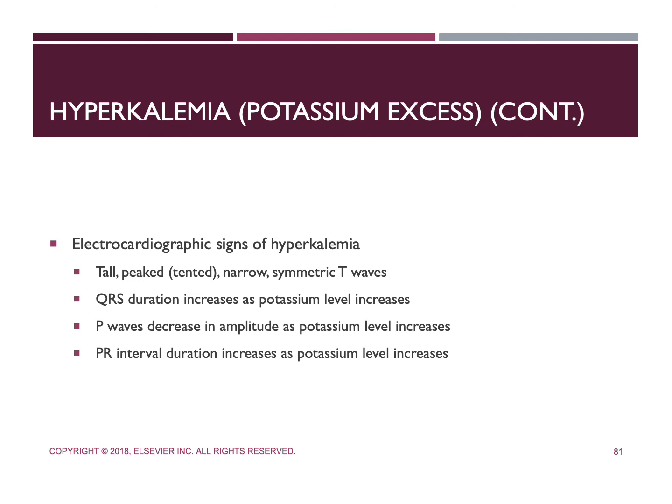As the potassium level rises, PR intervals lengthen and the QRS duration increases, which reflects slowed conduction.